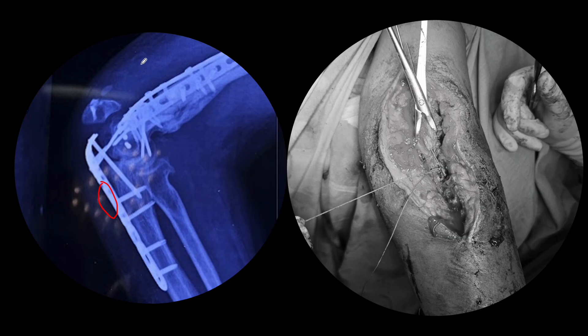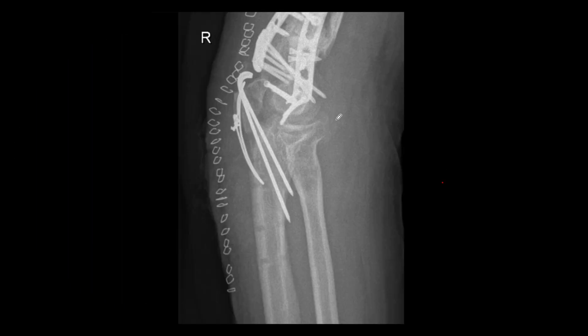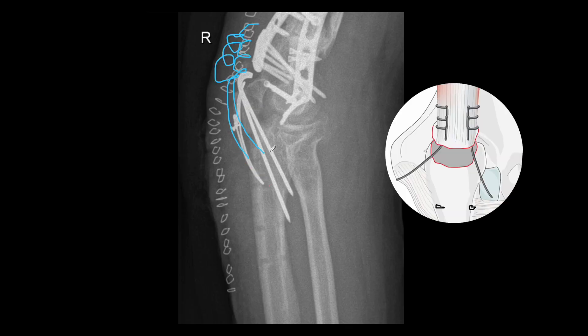What we did was again the same thing — we secured multiple Krackow bites in the terminal part of the triceps, made drill holes through this small fragment, and secured this small fragment to the proximal ulna. Even though the reduction is not very good because most of the fragment had already resorbed, the triceps has now been secured to the proximal fragment. You see there are two holes — one hole here and one hole here. The second hole is for a tension band we created to give extra stability, and one hole is for repairing the triceps directly to the proximal ulna spanning this small avulsion fragment.